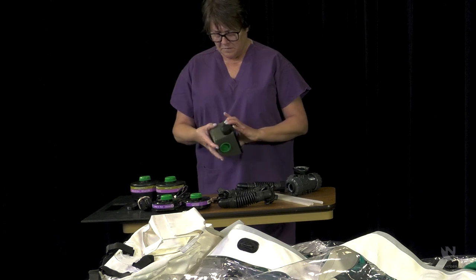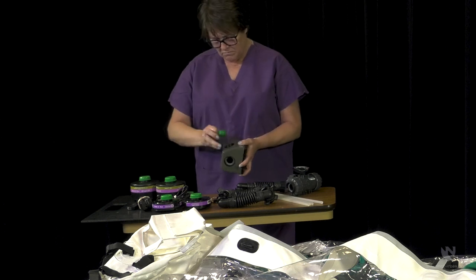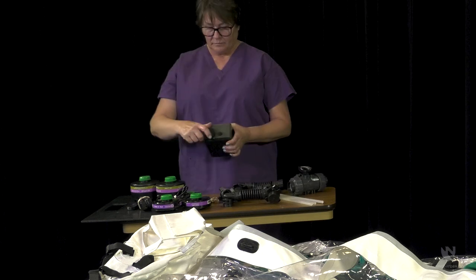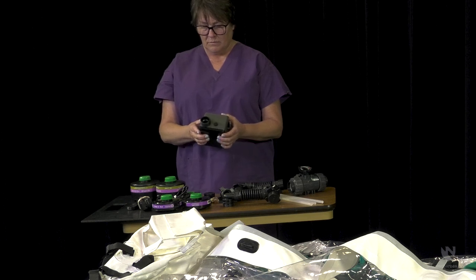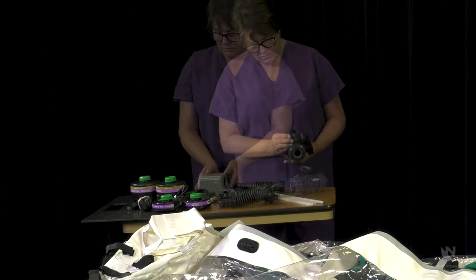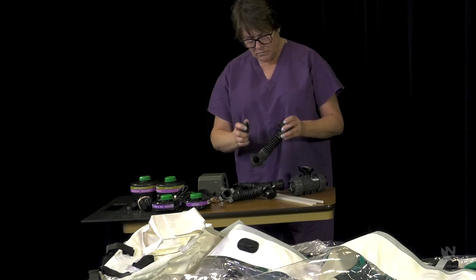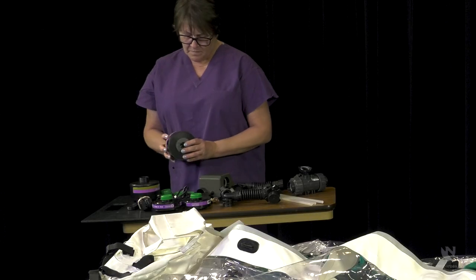Inspect the blower motor for damage. Remove the green storage caps and verify gaskets are present and intact. Check the blower motor for loose parts inside the unit. Power on the blower motor to ensure that it is functioning. Check the three-way valve for damage. Inspect the breathing hoses for cracks or holes. Inspect the battery charger for damage. Verify necessary filters are intact and not expired.